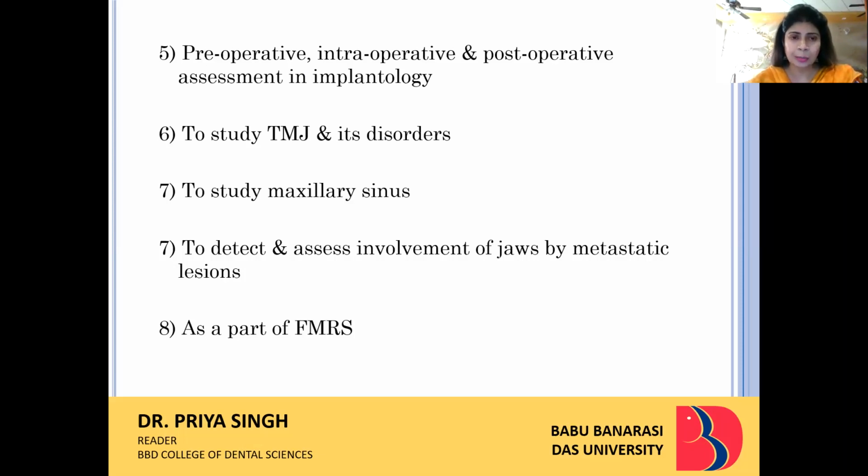So for patient selection, the bone assessment can be done with OPG, that is your panoramic view. During the procedure also, if you want to see how much you have drilled in, you can advise this particular modality. And following that, you can identify whether the bone has attached, whether osteointegration has taken place, and whether the implant is successful in the patient or not.